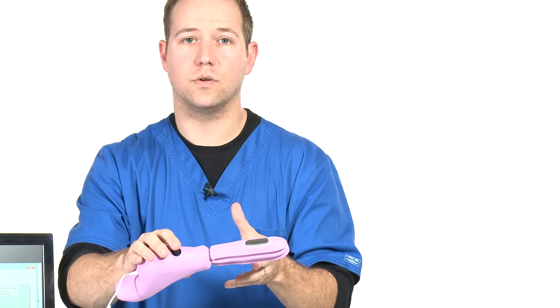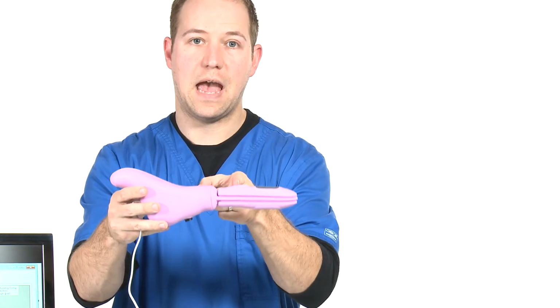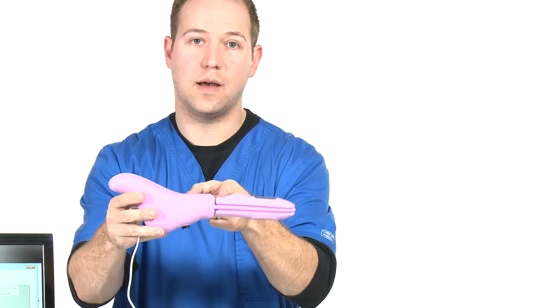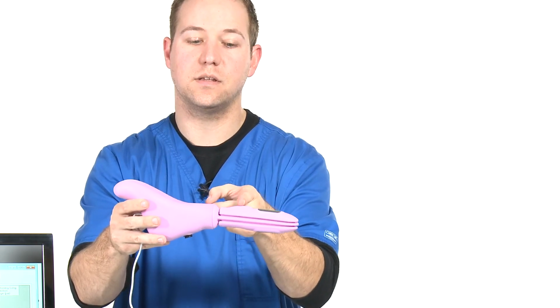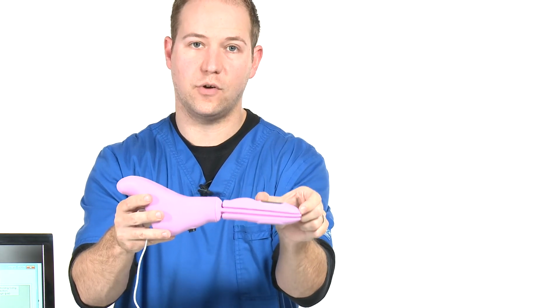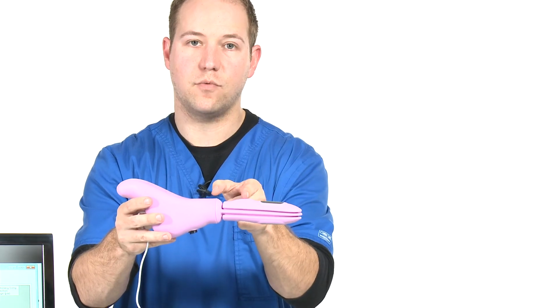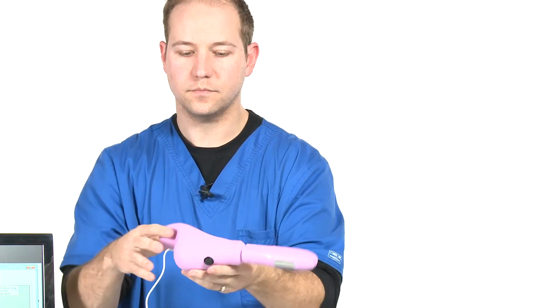You also want to make sure that the patient always makes sure that they insert the device at least halfway to the balloon, if not past this bump here. This is their orientation. If they're short of this bump and only have this in this far into the vagina, that's not going to work for your patient. At least halfway or farther.